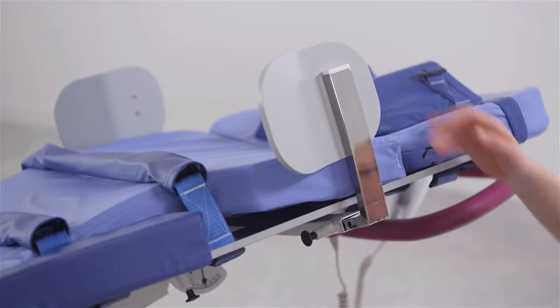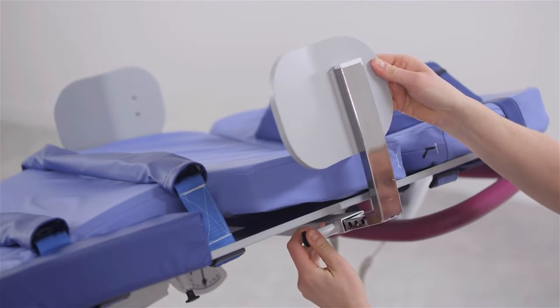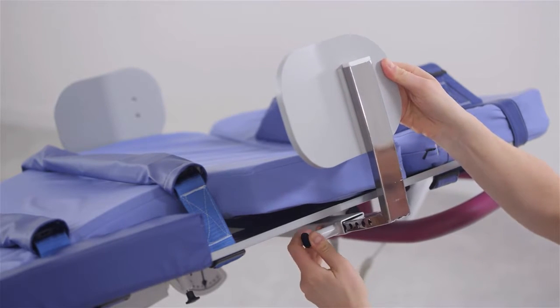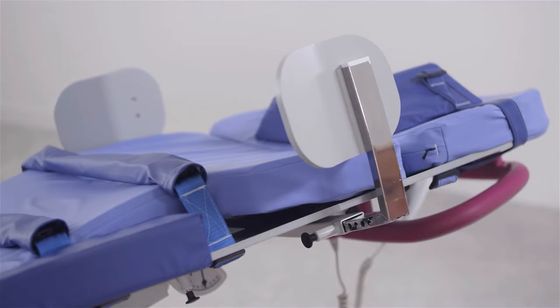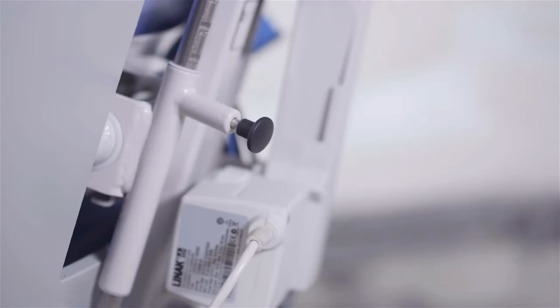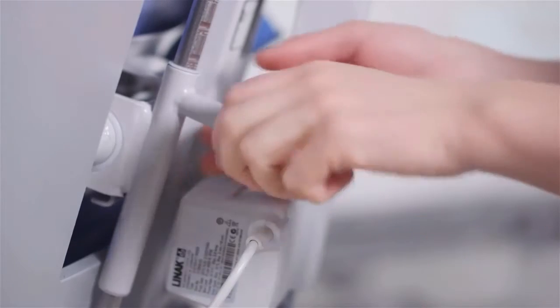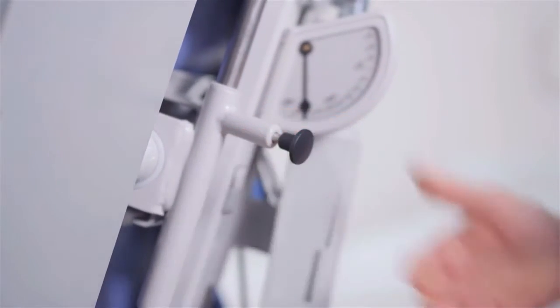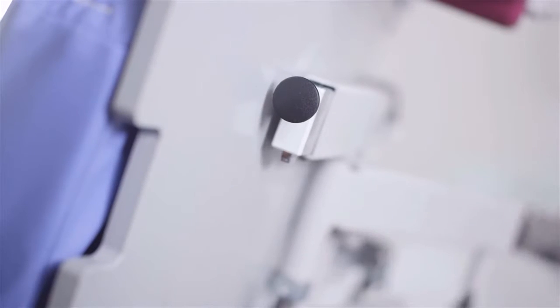Adjust the shoulder support by pulling the spring lock lever. Do the same to remove the shoulder support. Adjust the height of the armrest by pulling the spring lock lever and pushing the armrest up or down. Release the shoulder support by pulling the spring lock lever. It's advisable to hold the shoulder support with one hand when releasing it to minimize its movement.